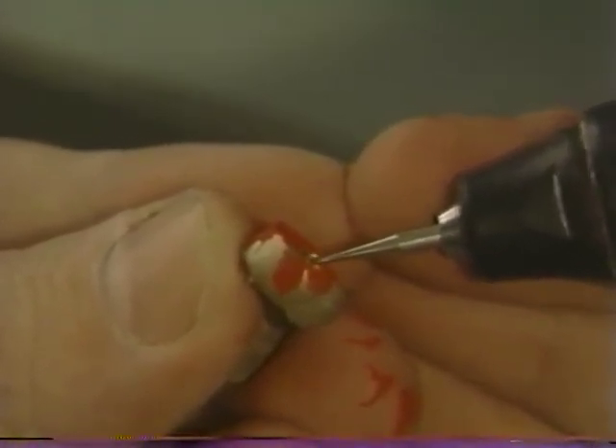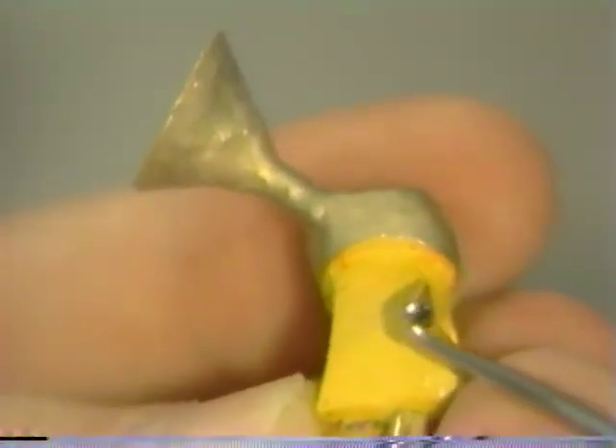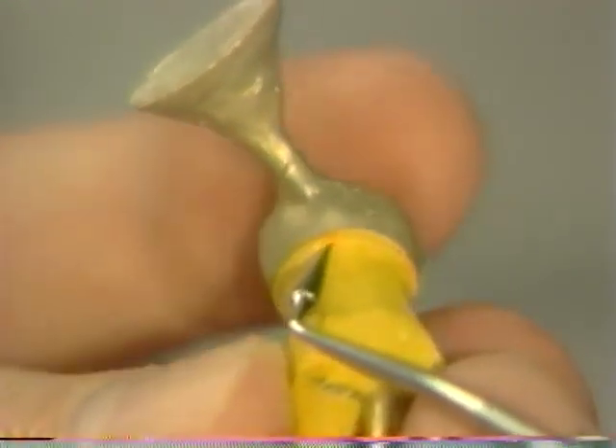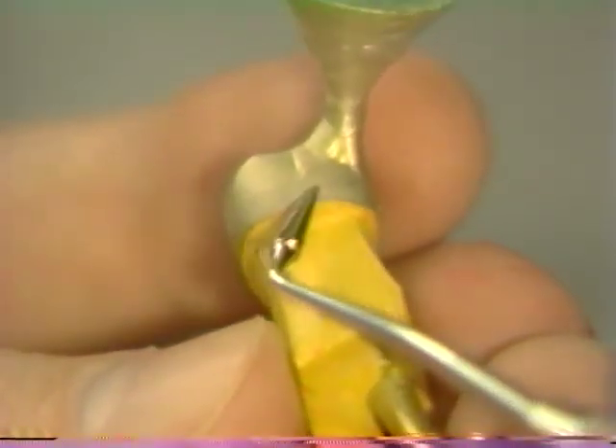An alternative to this technique is the use of rouge and chloroform as a marking agent. Once the adjustment has been made, the casting is reseated on the die and the process is repeated until the casting fully seats. At that time the marking agent is removed by placing the crown in some distilled water in an ultrasonic cleaner. Once the casting is fully seated, it is inspected for marginal integrity as well as stability on the die. No discrepancy should be present at the junction between casting and die.